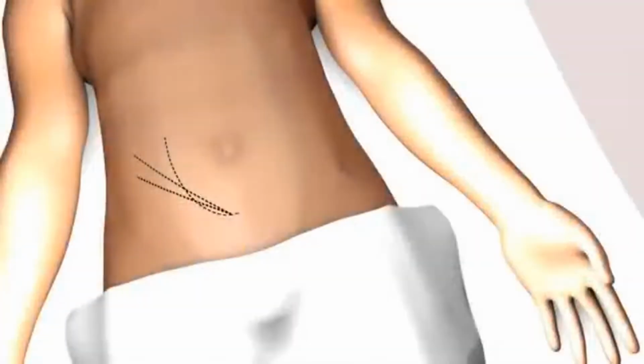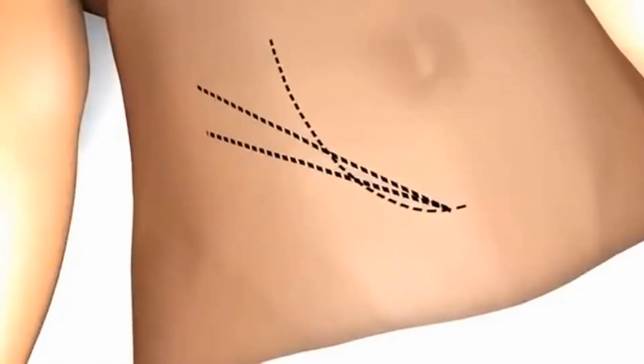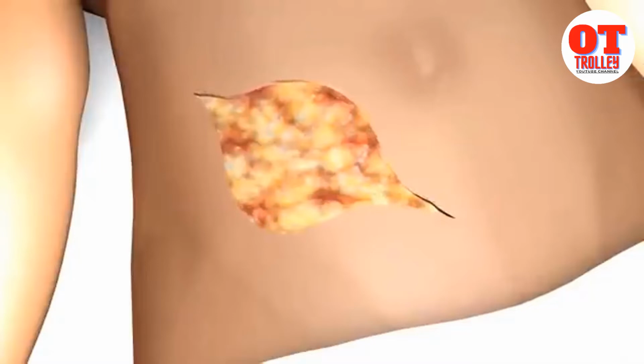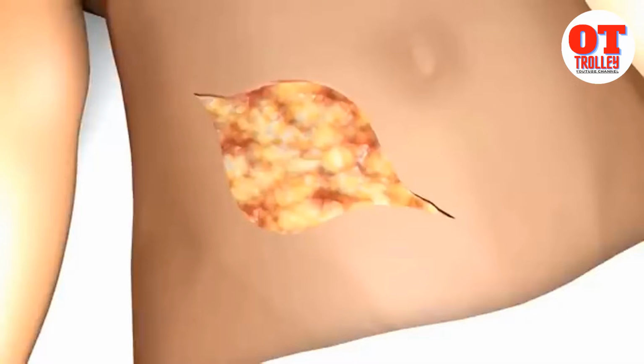Primary kidney transplantation into the right iliac fossa is shown. Some technical details are provided that may require basic surgical and anatomical knowledge. The procedure starts with opening the skin in the lower abdomen with a surgical knife. The hockey stick or oblique incisions are most common. The length of incision depends on the habitus of the patient and ends 2 cm above the pubic bone, which allows access to the retroperitoneal space, the iliac vessels and the bladder.